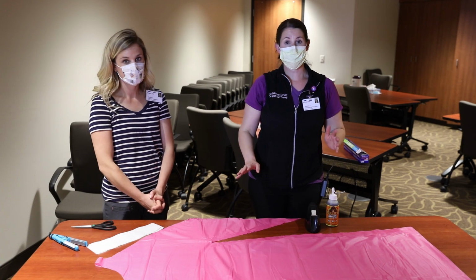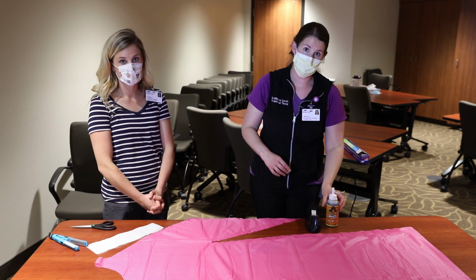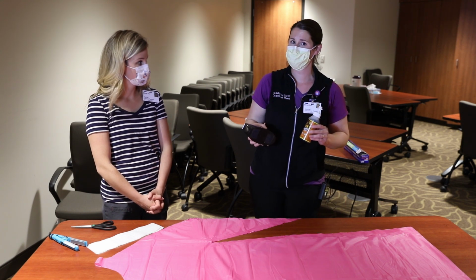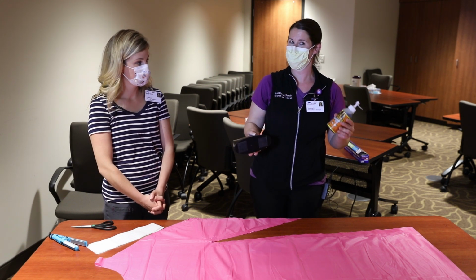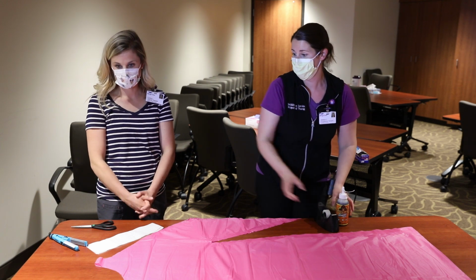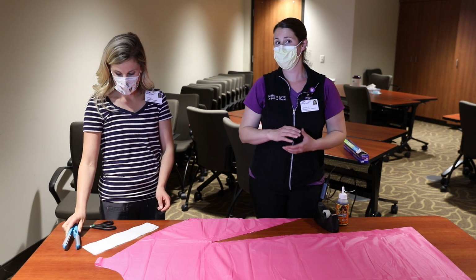The next step, we're going to seal the edges. Now this process, we went through many stages of trial and error. First, we tried taping the edges, which tended to fall apart too easily. Then we tried gluing, which was also kind of messy and just didn't quite hold well. So we finally started doing the flat iron to help melt the edges together. And we'll show you that next.